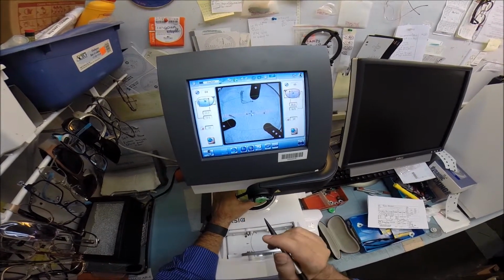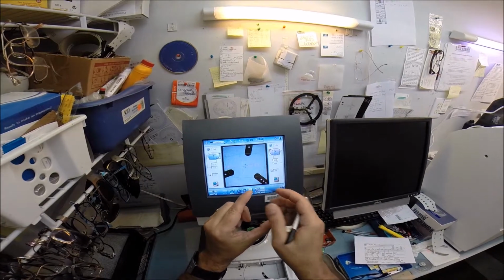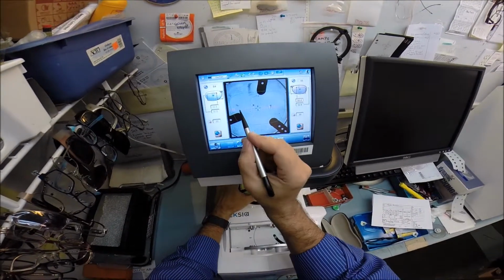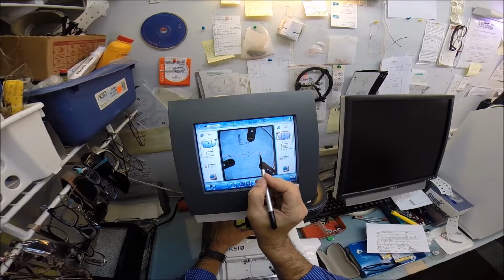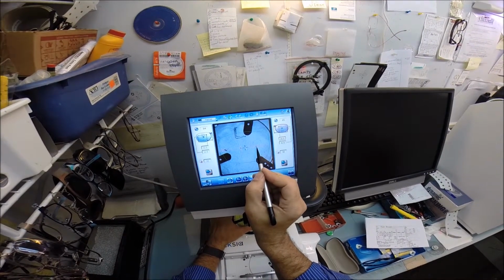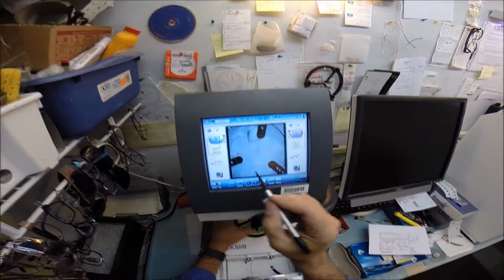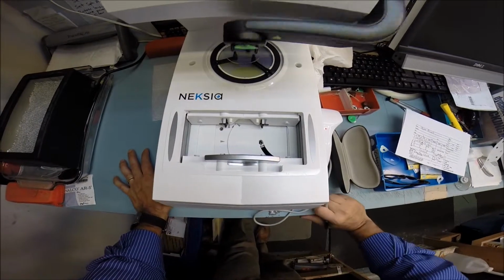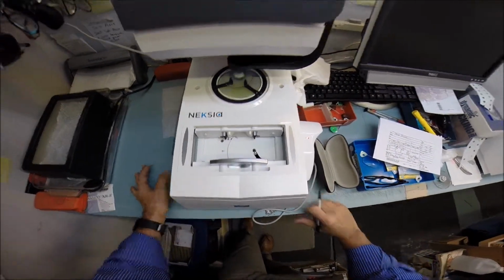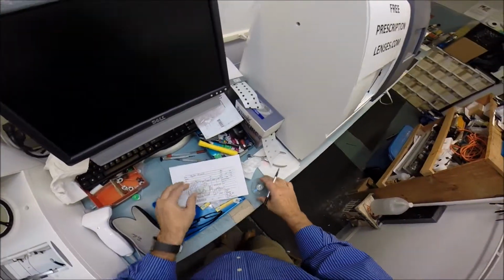So again, I'm going to get everything lined up just perfectly. Yes, that smear mark, I smeared the red that's on there. That's why you see a big smear mark over here. But it's good enough to get everything lined up because I'm using that one as a meridian. When I get it done, there's little yellow X's there. Hopefully you can see all that. But we're lined up perfectly. And then hit the button again, and that's going to go down and put the block onto your lens. Press that down there firmly again.